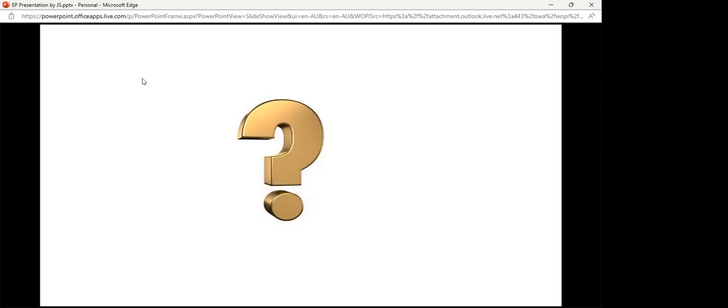So the maximum time you wait during the ablation in the EP lab, is it 30 minutes? It varies on the operator. Most operators I work with wait around 20 minutes from the point of block. When you've performed that ablation and you've seen block in the pathway, we usually sit around for about 20 minutes. Now, we don't just sit there. During that 20 minutes we're doing pacing maneuvers, which we briefly went through just before. So we're constantly pacing the ventricle and making sure that we have lost that VA conduction through the pathway.